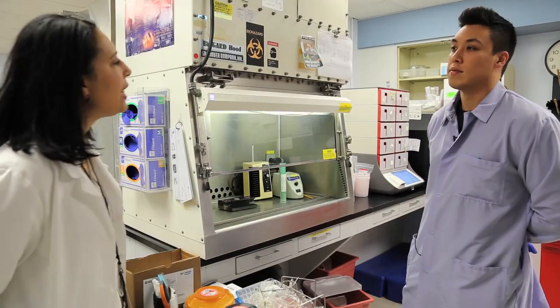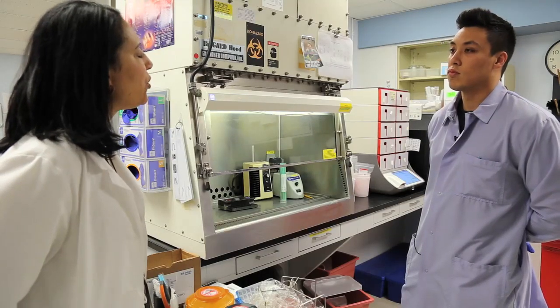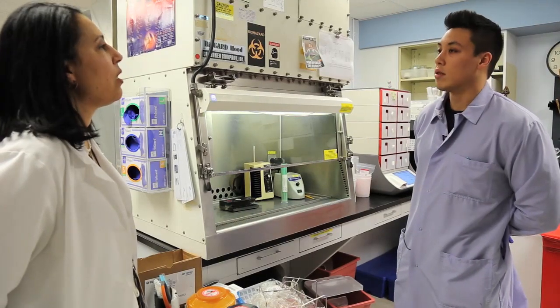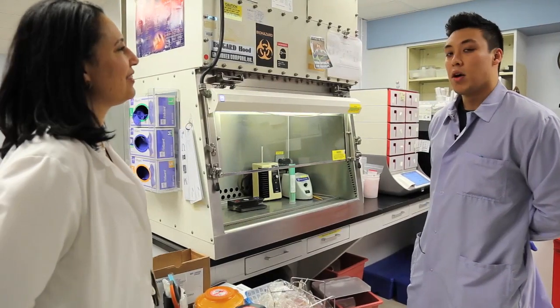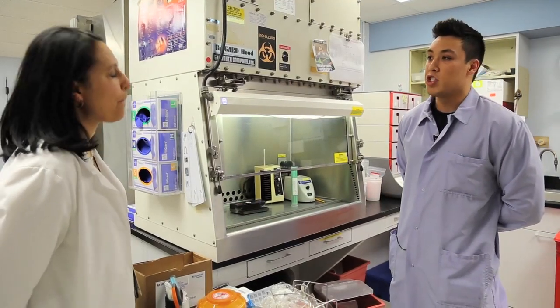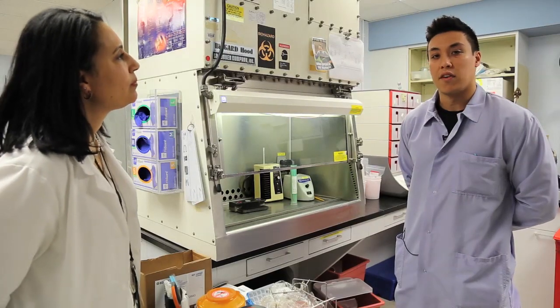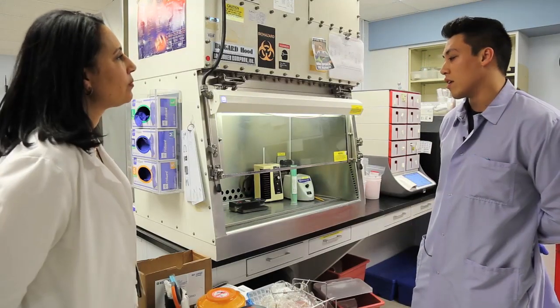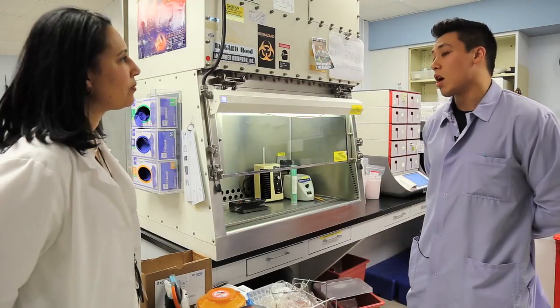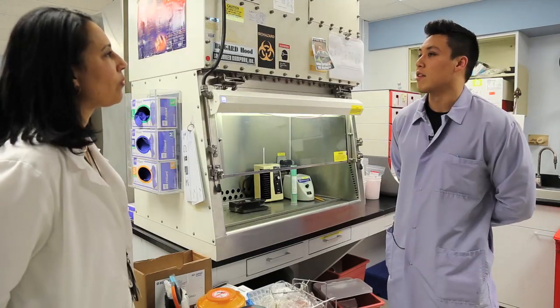Okay, great. And so with the BioFire, I understand that you can test for many different organisms. Sure. But not everything. Right. Each assay has a specific list of potential pathogens and targets that it does test for. It's a wide list and it's different for every assay. However, it is not completely comprehensive. There are also other specific PCR options. Usually those are send-out tests that are done in other reference labs.